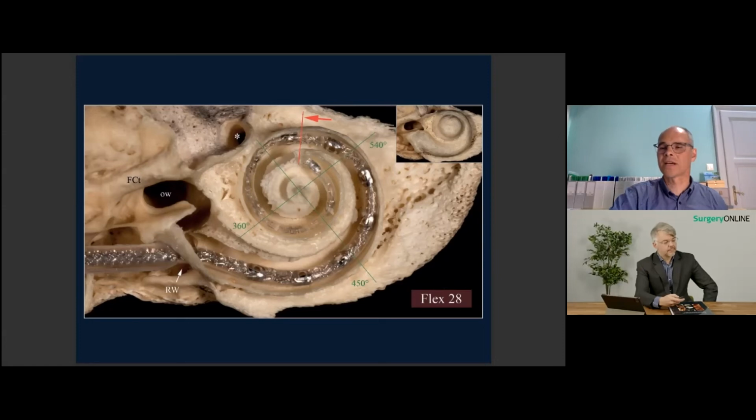If you make impedance measuring, you can see it this way, because here in this area you are far from the ganglion area. Here it is very close, and here in the apical area, again relatively far. If you stay in this area, your impedance measuring does not have such a curve, but a relatively horizontal level.